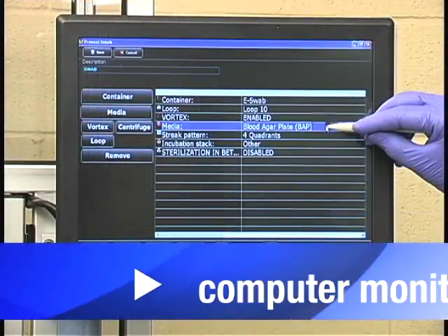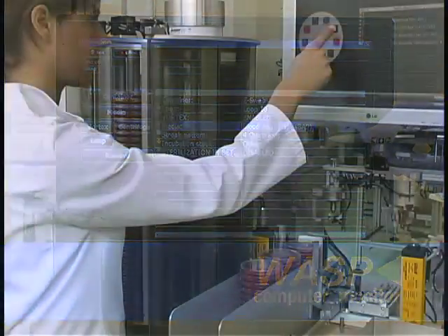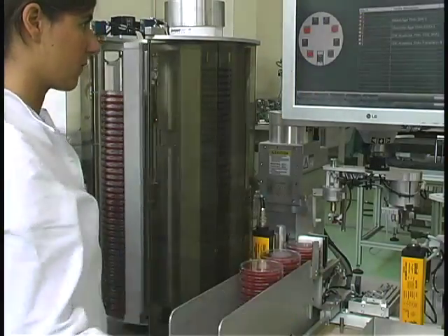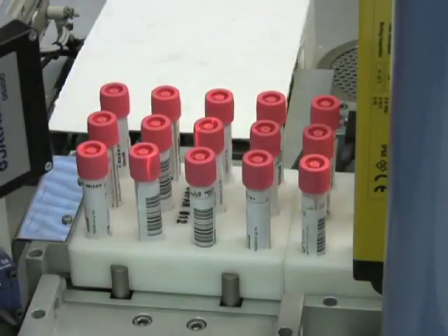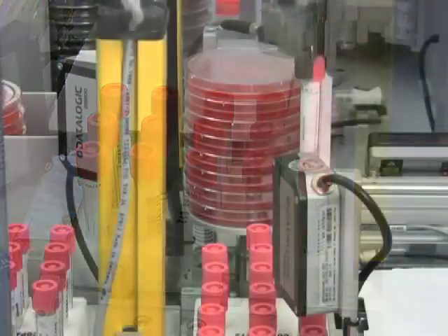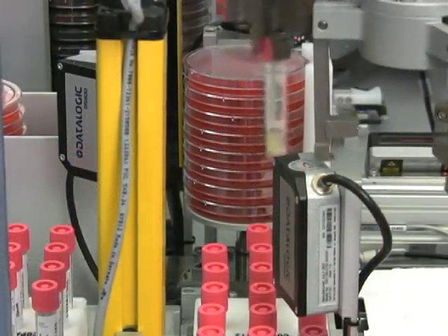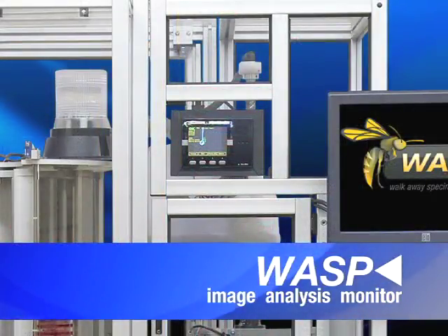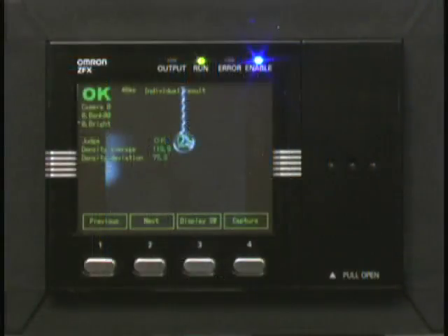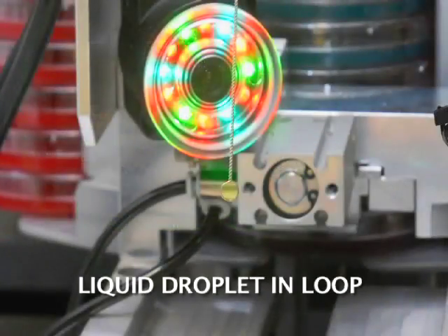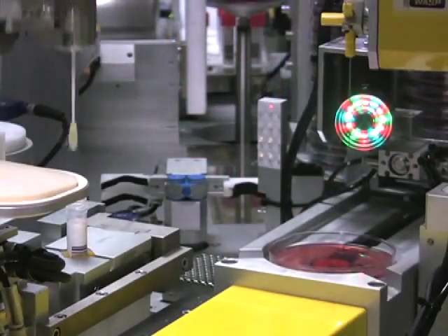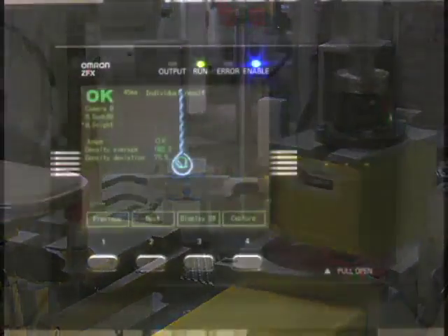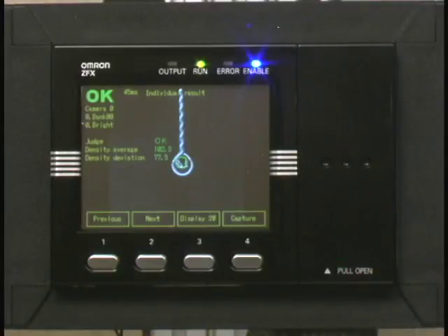The WASP instrument uses a touchscreen command system with Windows-driven software and does not require a keyboard. In designing the instrument, the goal was to streamline workflow and maximize the use of space. The WASP has a built-in camera that captures a photo image of the inoculating loop every time it is withdrawn from the specimen container. The image analysis monitor looks for a droplet in the loop; if a droplet is detected, the instrument understands the loop has reliably collected a sample and the specimen is then processed. The operator is not required to stay by the image analysis monitor.